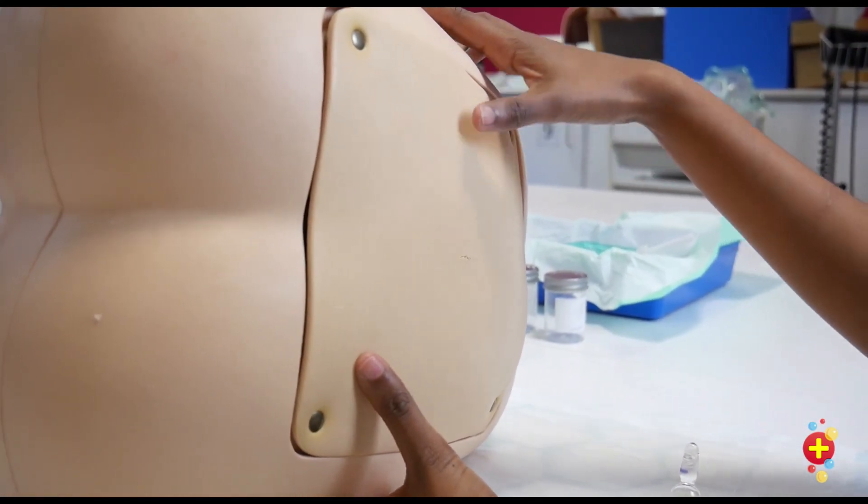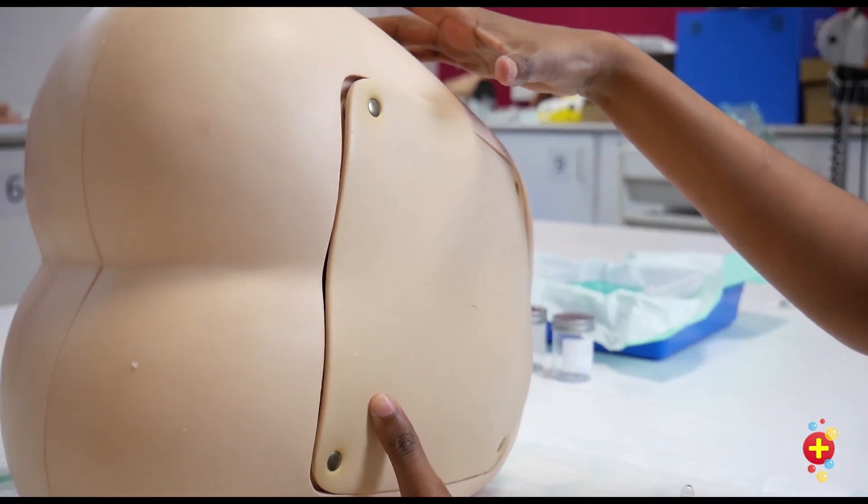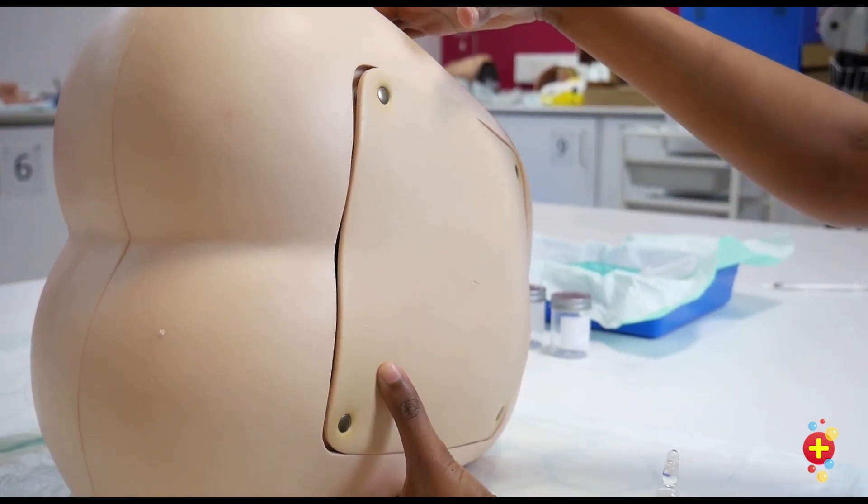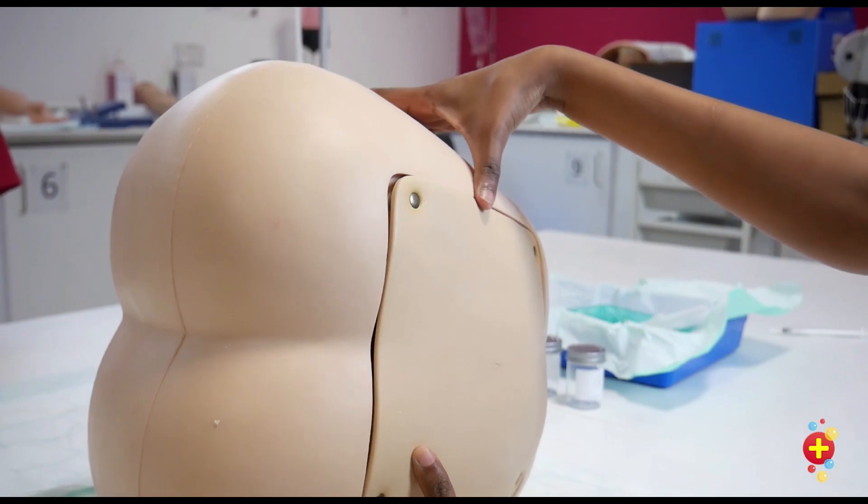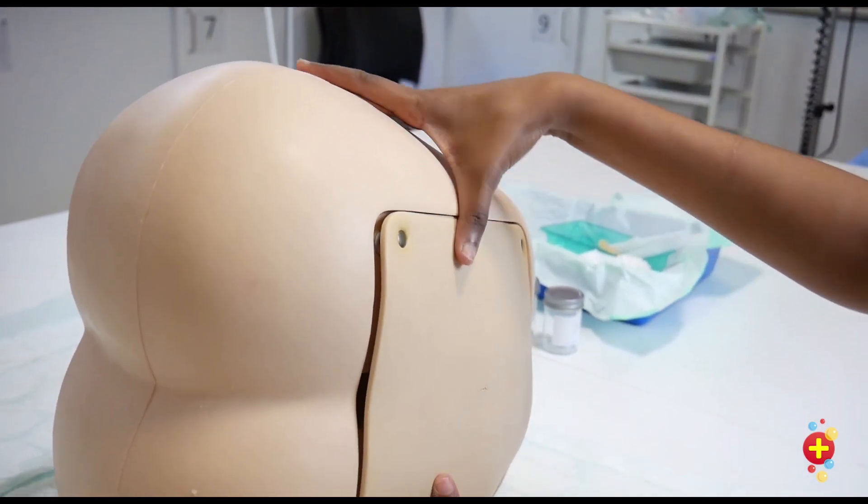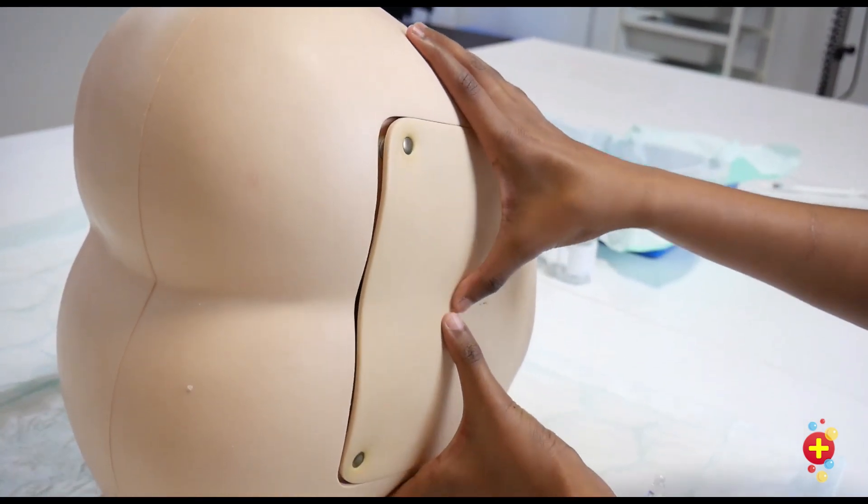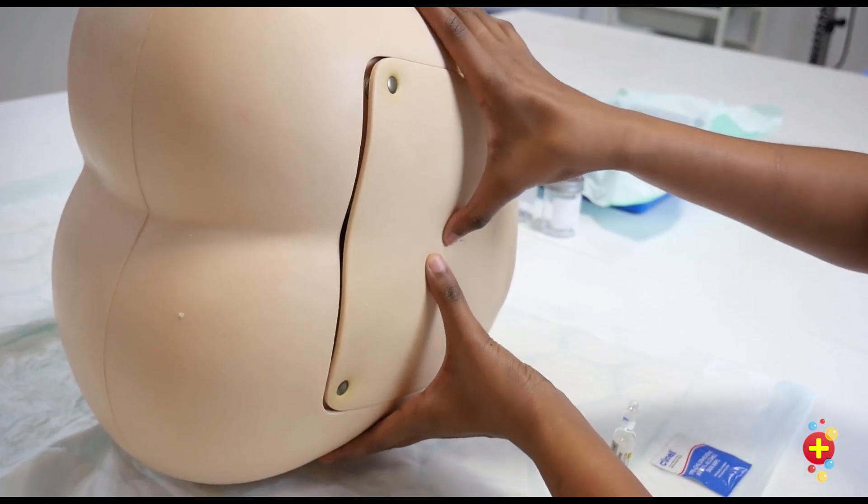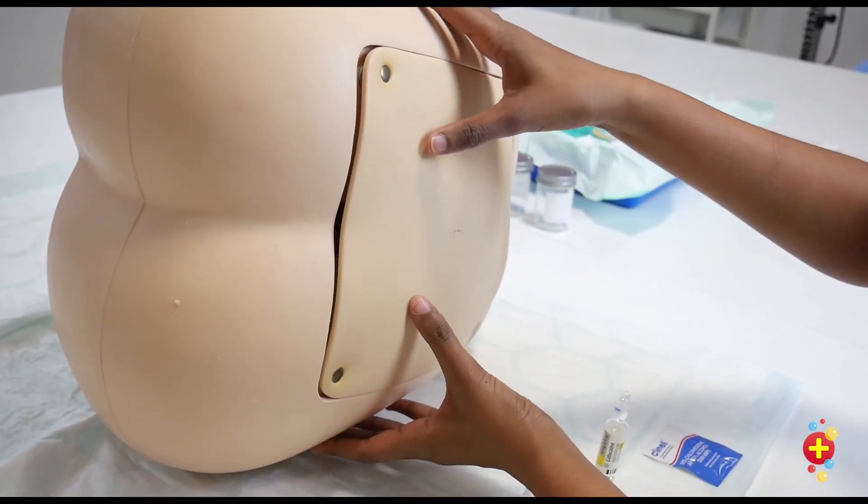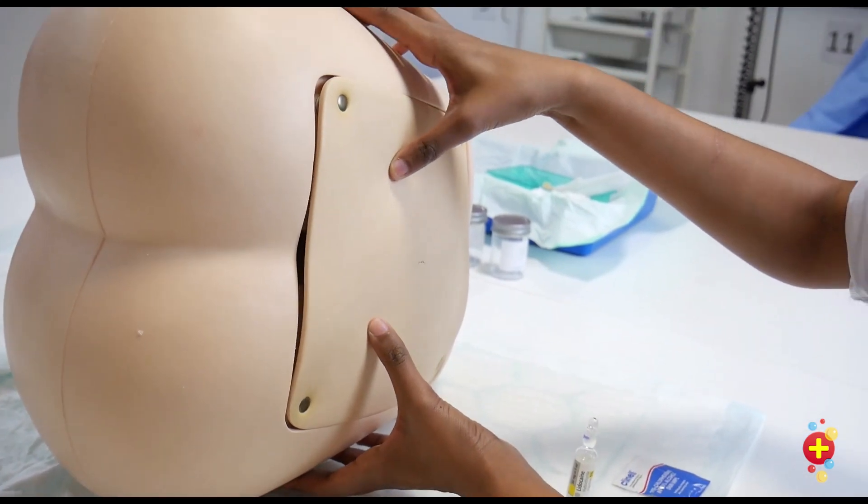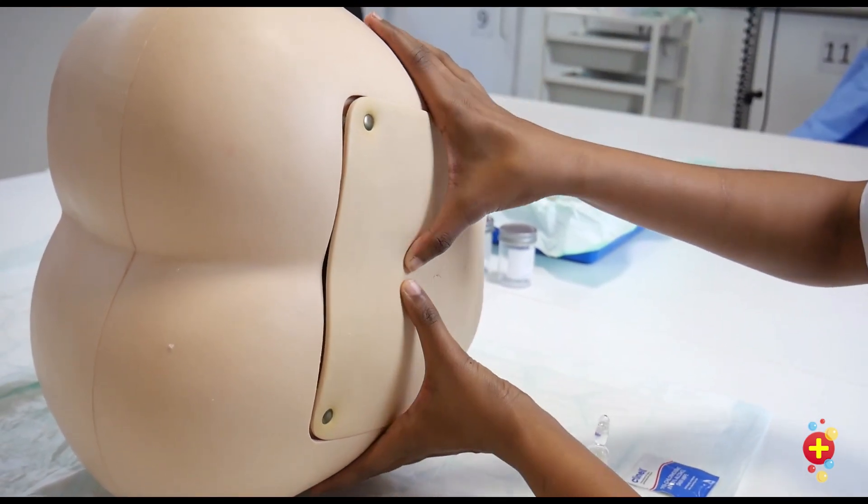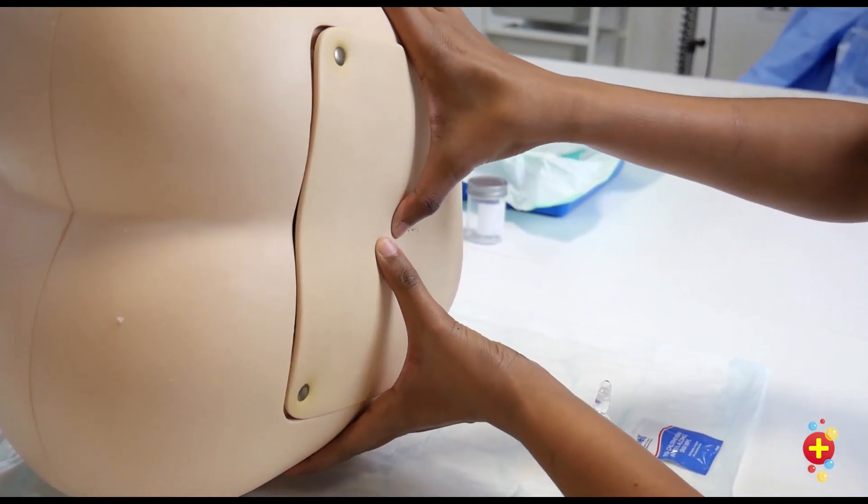When feeling the landmarks in a smaller child such as a neonate, you can feel from the anterior superior iliac spine across at the front, feel across to the spinous processes at the back to find your landmarks. In a larger child, you can feel the posterior superior iliac spines and feel to the midline to the spinous processes there.